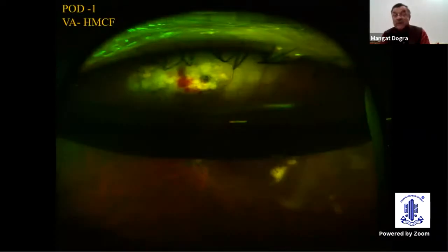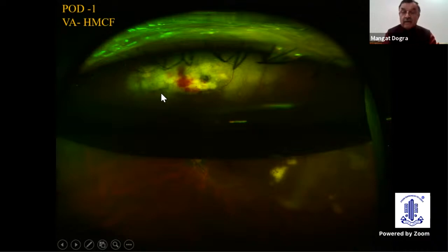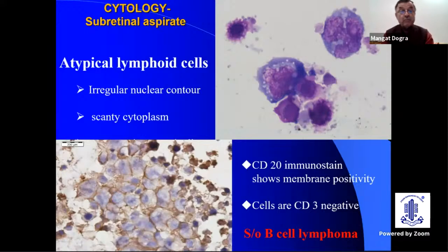Once the vitrectomy with subretinal biopsy was done, you can even demonstrate through the gas a very good image of the area in the periphery where the biopsy was taken. So you can very nicely document everything that has been done, and you can even show it to the patient sometimes. Of course, I'm not going into detail here.